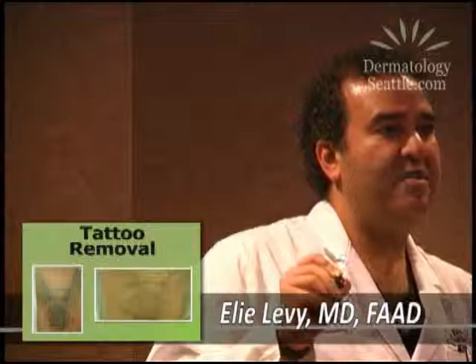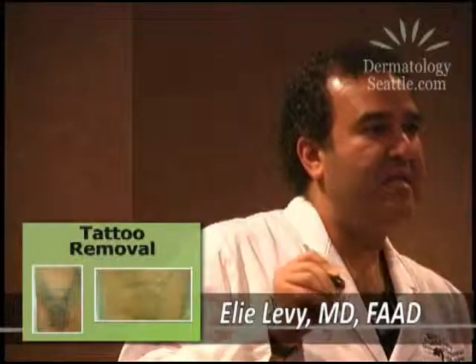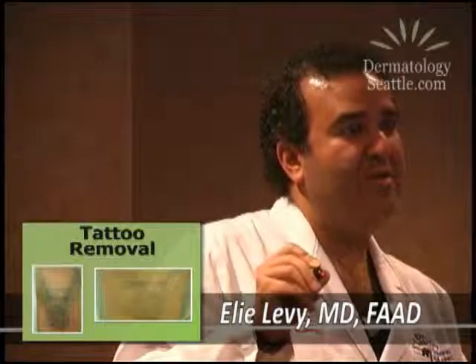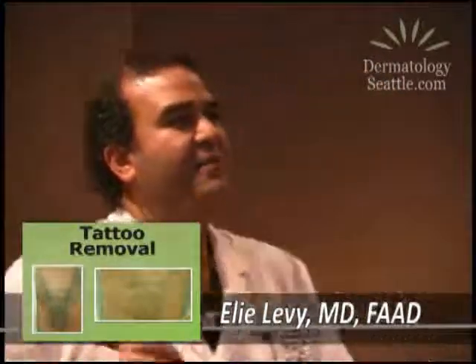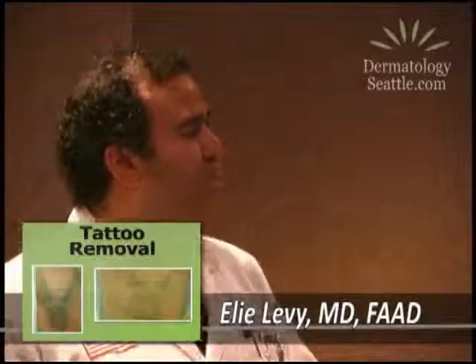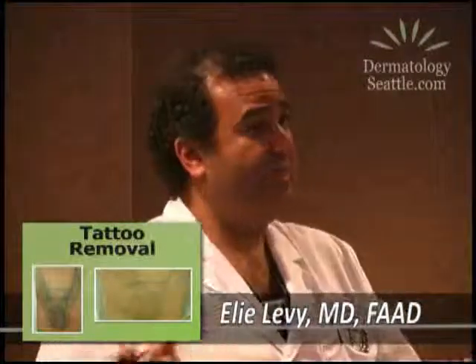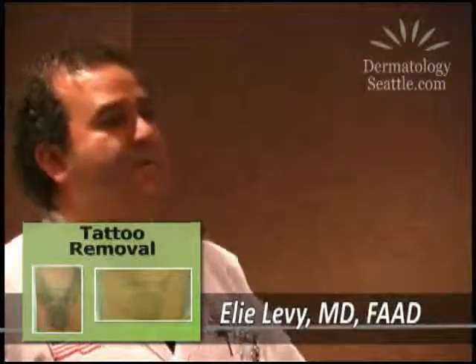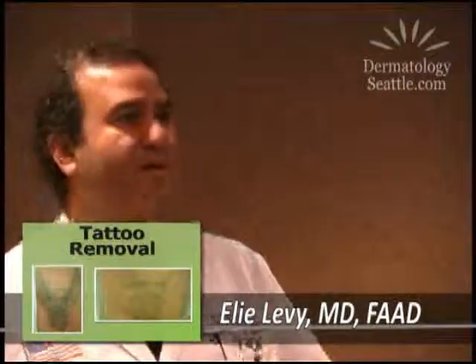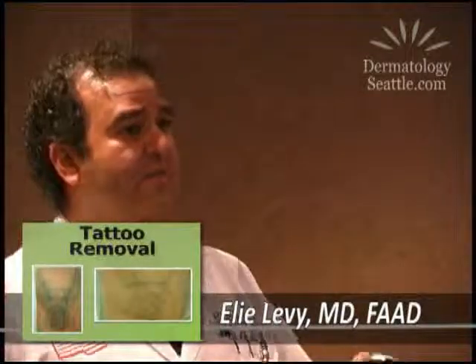You can see right over here. Do you see how over here where it says, like right over here, and then over here, see how it's gone? Right there. And then we trace it all out. Again, 5 or 7 treatments. Sometimes we numb the skin locally. Usually it's pretty tolerable. We don't have to numb up the skin, but that's available. Just like we numb it up for taking off moles or whatever, we can numb up the area, and you don't feel anything. Get the treatment, come back once a month, 5 or 7 treatments, and it's gone.